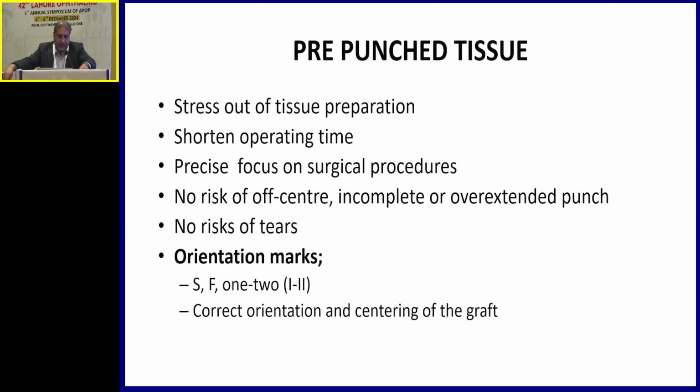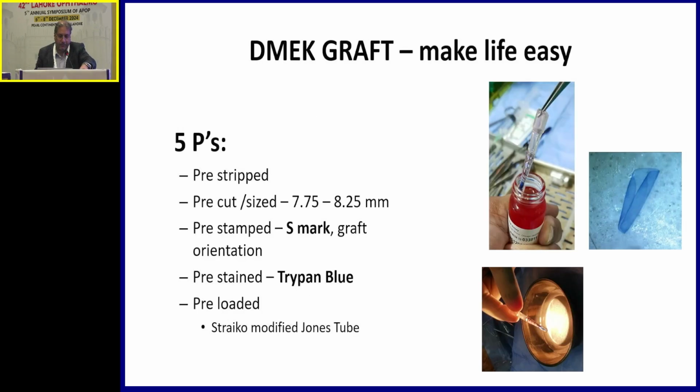No risk of tears, and we are provided with the orientation marks, that is the S or F, to have the correct orientation and centration of the graft. So DMEK preloaded makes my life and everybody's life easy. And I have developed these, the 5 Ps.